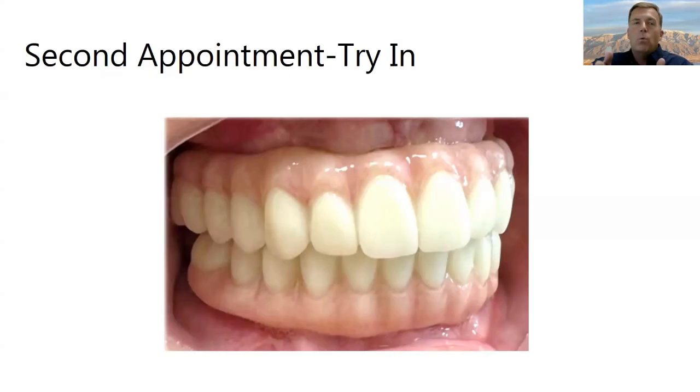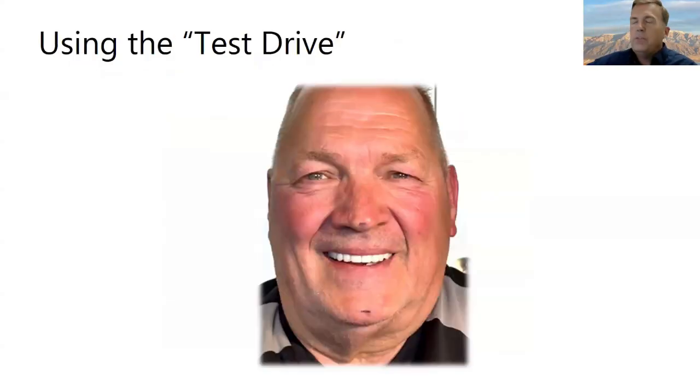But if you need to make more significant changes, we'll probably want to do one more prototype. So, test drive. One of the cool things about a digital workflow is that you can send it home with the patient. So if the person was wearing a denture or if they broke their provisional, that's okay. Give them the prototype. They can wear it.